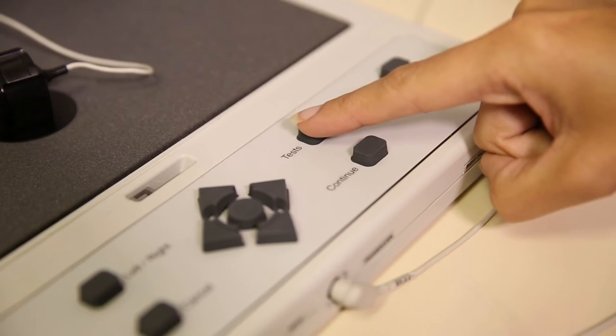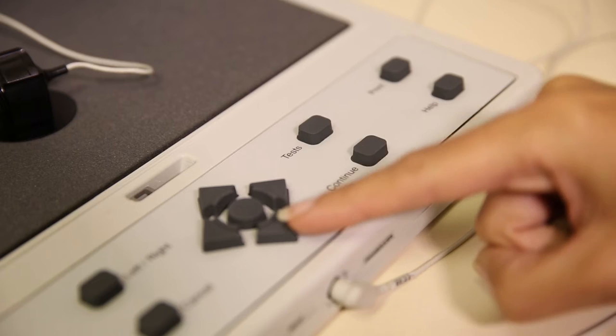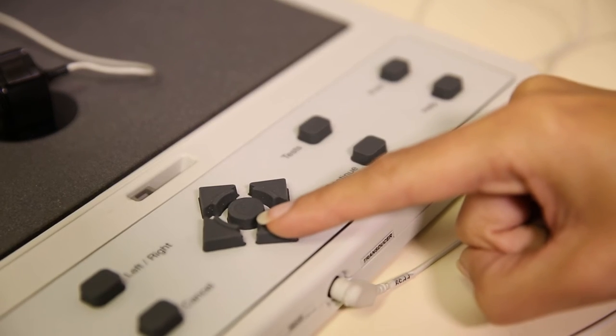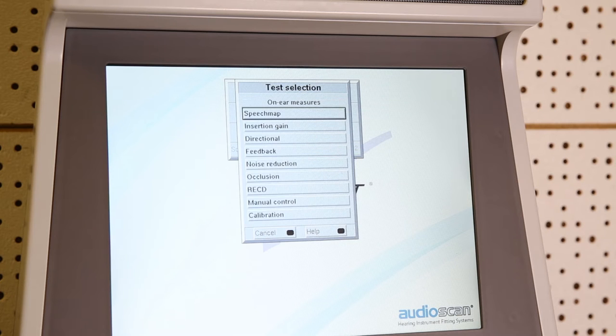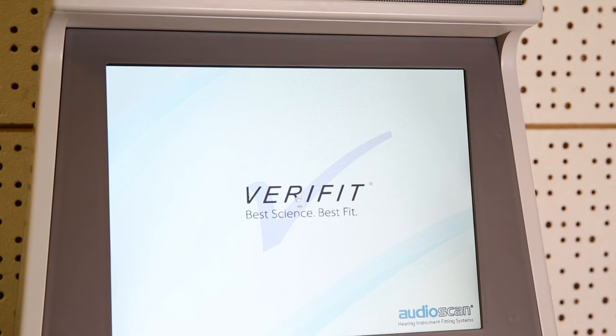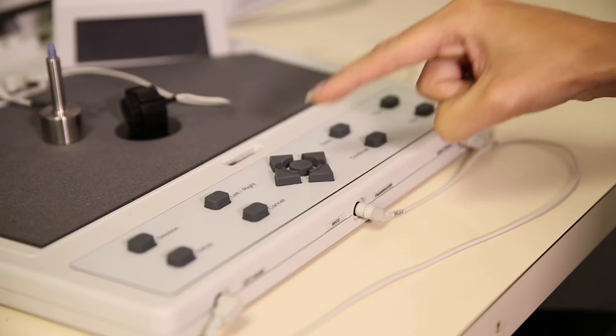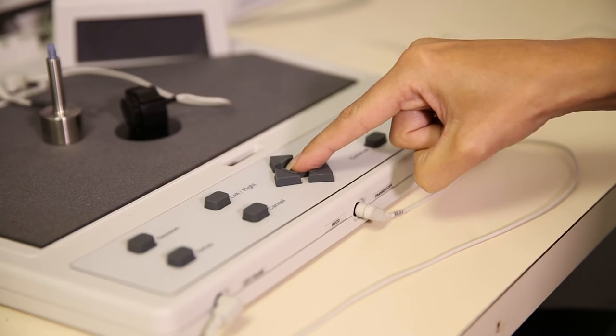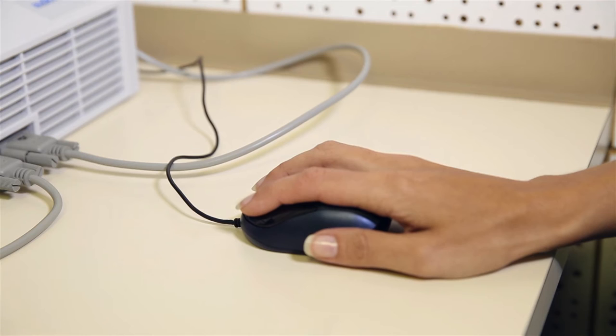Go to tests, then on ear measures, then select speech mapping. You can do this by pressing the buttons on the machine or by using the mouse.